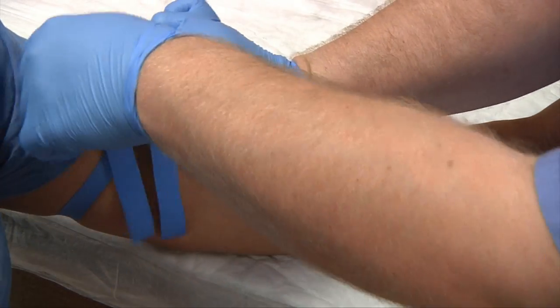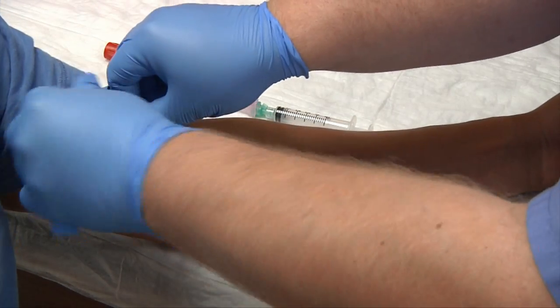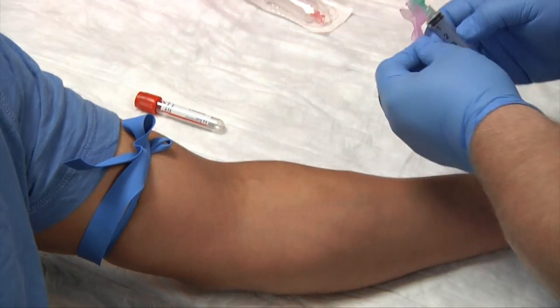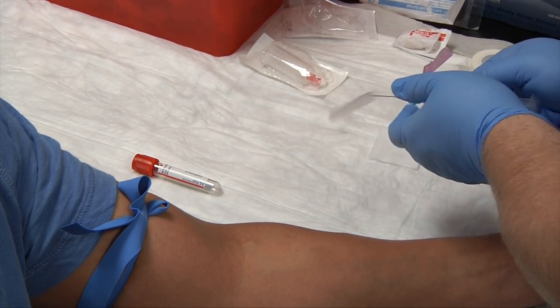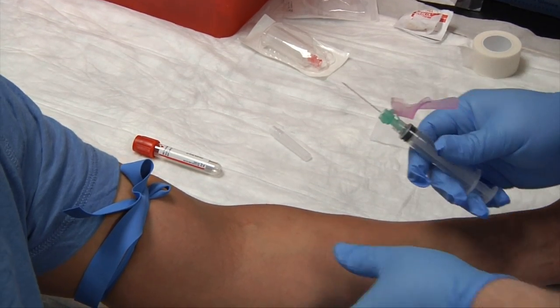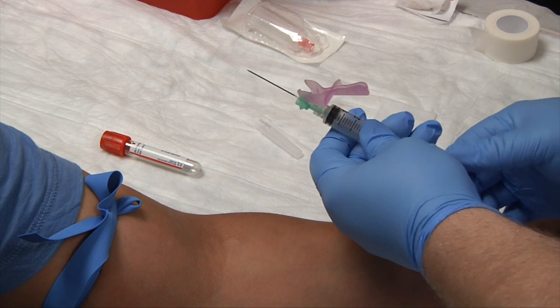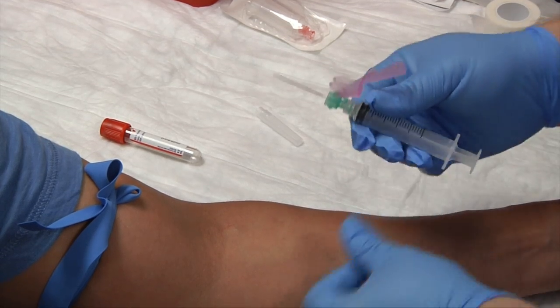Place our tourniquet and make sure that the ends are up. Have our patient make a fist. Go ahead and pull back the safety cap and release it down. Check the needle — make sure everything looks good. With the syringe, before you stick your patient, pull back on the plunger to loosen it, as syringes can sit for a couple of years and you want the plunger loose before use.